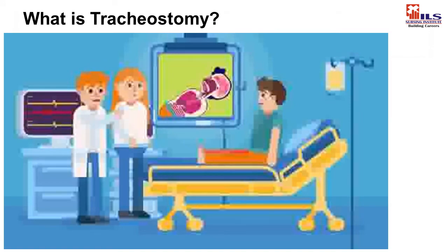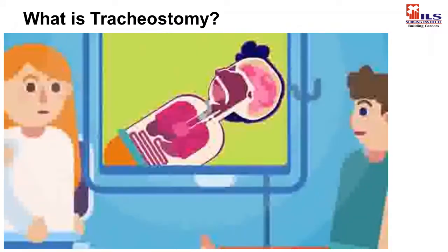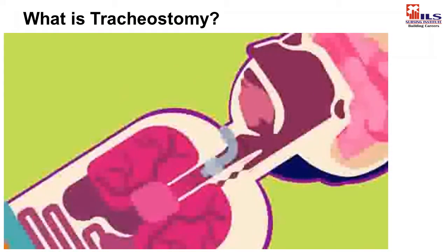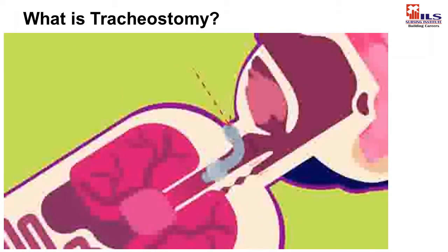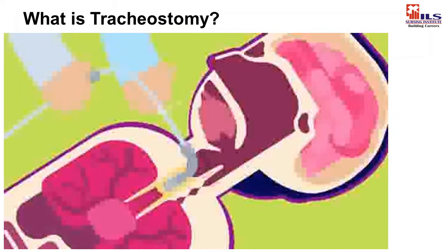Care. After tracheostomy is done, certain precautions and care is required to ensure proper functioning of the tracheostomy tube and to prevent complications. The tracheostomy forces the air to bypass the nasal and oral passages. Hence, the air entering the tracheostomy is not adequately humidified. This dry air leads to increased tracheal irritation and secretion production. Because these secretions may lead to crusting and blockage of the tracheostomy tube, the first point regarding care is adequate suctioning of the secretions through the tracheostomy tube.